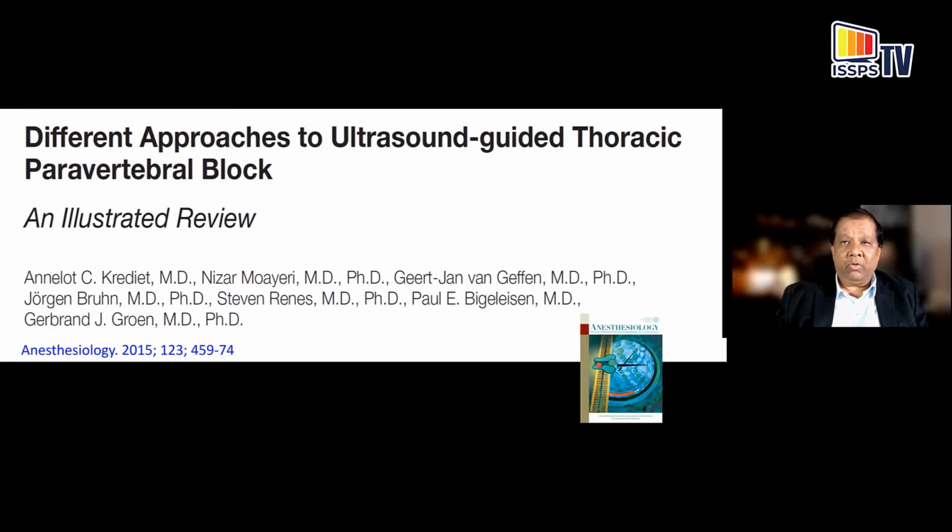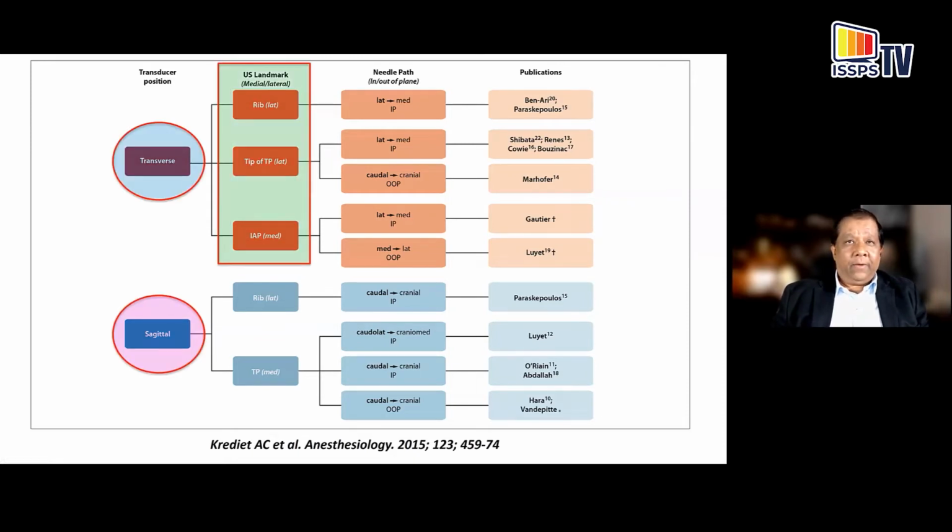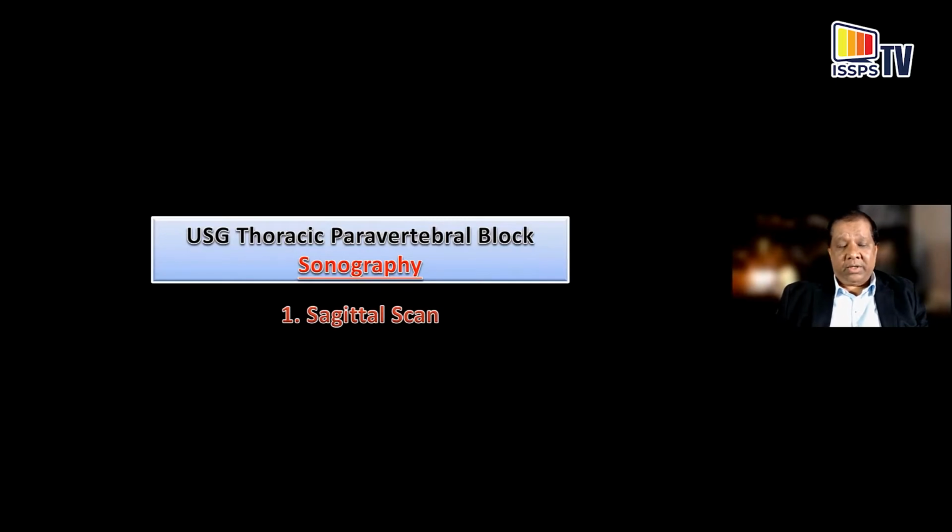This actually enumerates all the different ultrasound-guided techniques using the transverse or the sagittal scan, and using different osseous landmarks with different approaches for needle insertion, etc. So what should you be using? We will try and address some of that in this discussion.